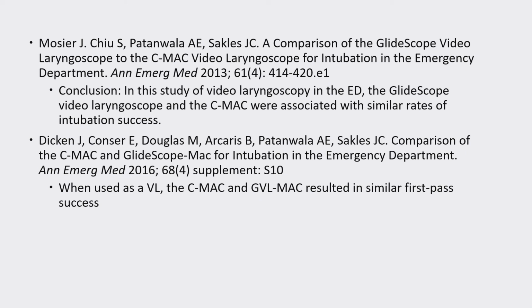For the comparison of the C-MAC and GlideScope, some studies have been done. One study was done by Mosier and colleagues in the emergency department, published in Annals of Emergency Medicine, and the conclusion is that in the ED, the GlideScope video laryngoscope and the C-MAC were associated with similar rates of intubation success. Another study was done again in the emergency department and published in Annals of Emergency Medicine, and in this study, when used as a video laryngoscope, the C-MAC and the GlideScope resulted in similar first-pass success.